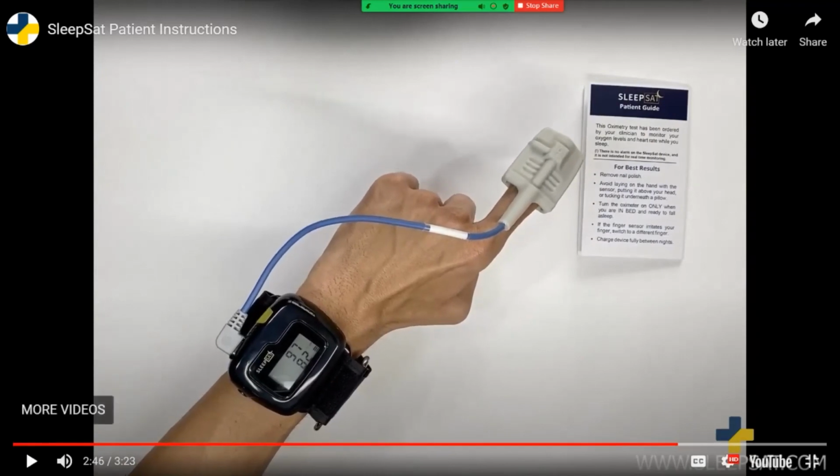A more concise way to say that to your patients is: if when they wake up in the middle of the night they do not see a red light being emitted from the end of the probe, go ahead and hold down that power button until they see that red light return. In a dark room, that'll be very evident.